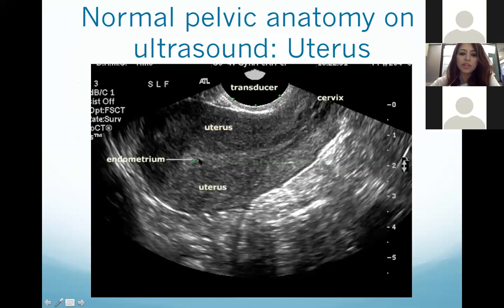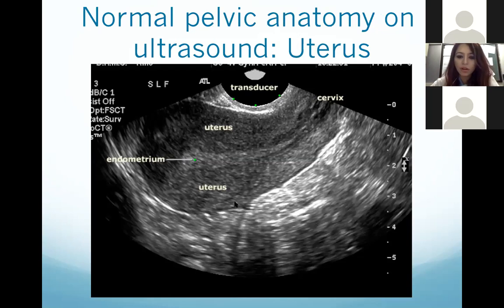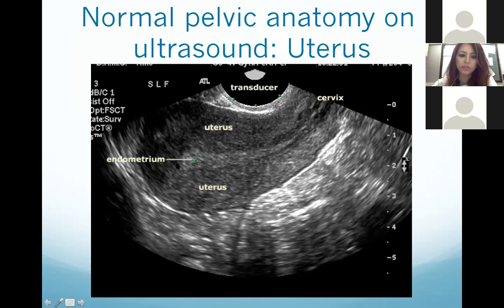On your screen you can see a normal pelvic ultrasound with a normal uterus. On ultrasound you can only see different shades of gray, so you have to evaluate and identify each organ by its shape. The shape seen on ultrasound is exactly the same as in your books. This is the uterus; this is the myometrium — this black area — and in the center, this white line is the endometrium.